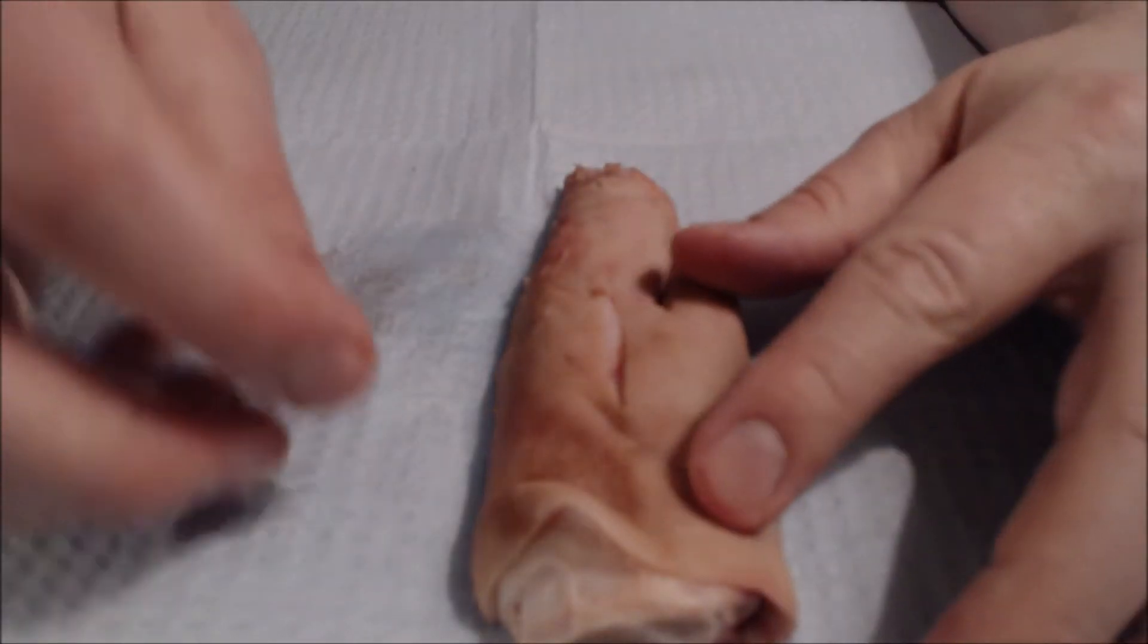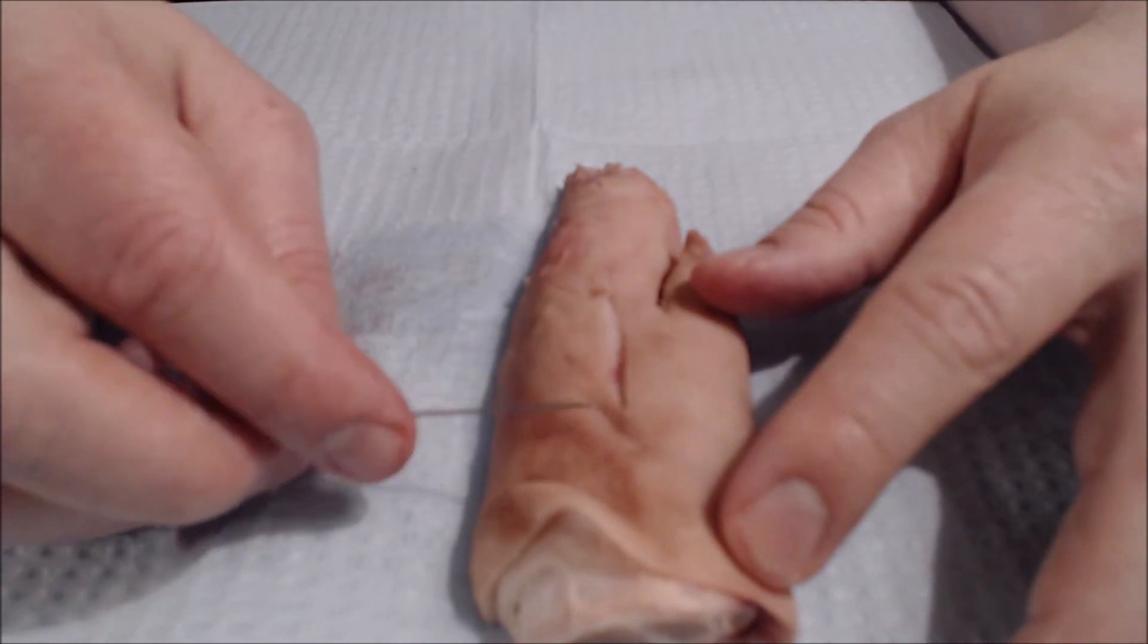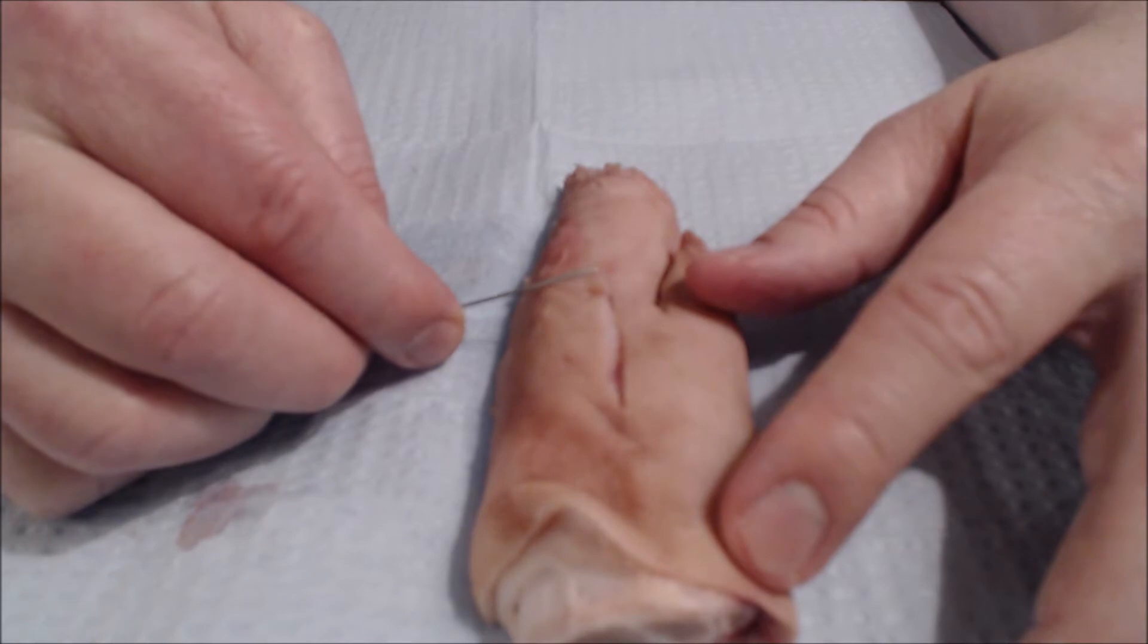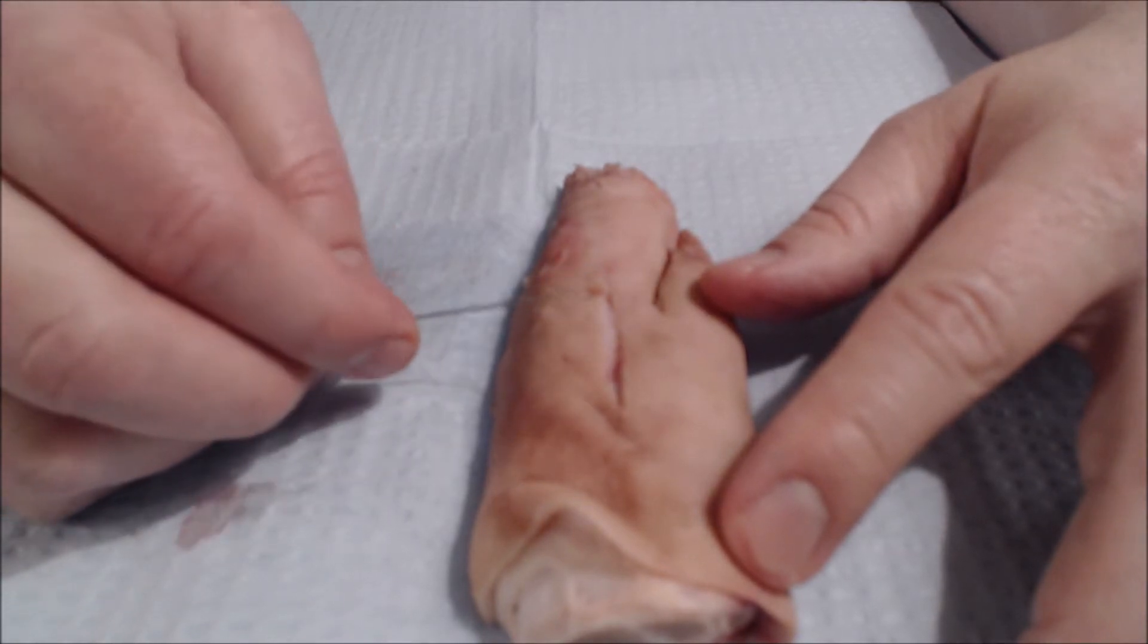All right, we are back again. We're going to place sutures in a running fashion as we did in the previous video, but this time we're going to lock them.